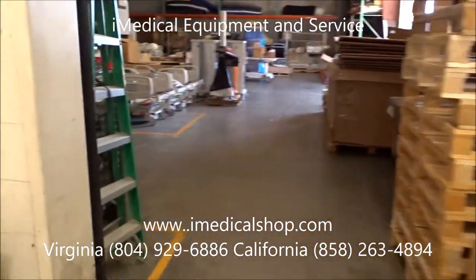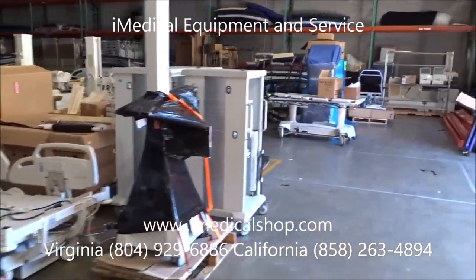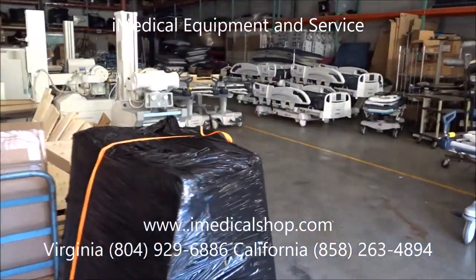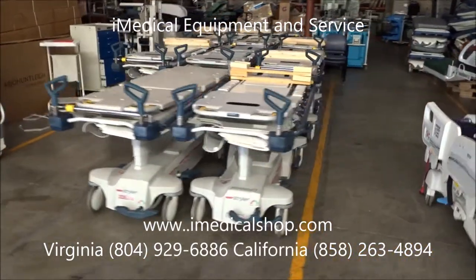The whole thing will be reassembled and it will basically go out with a brand new mattress pad. iMedical Equipment and Service is the largest dealer for medical stretchers in the United States. This is the staging area where equipment gets ready to go out.